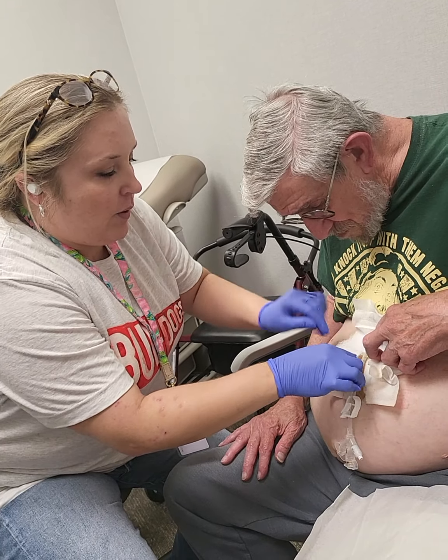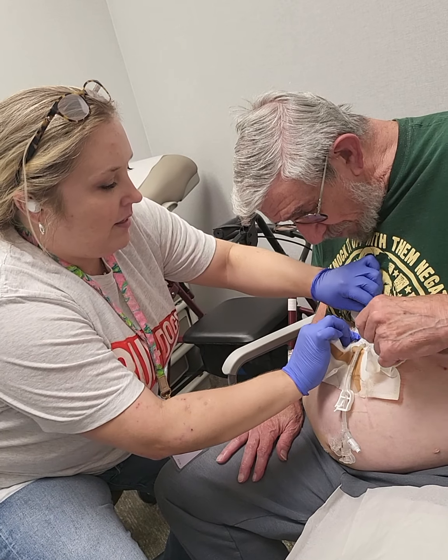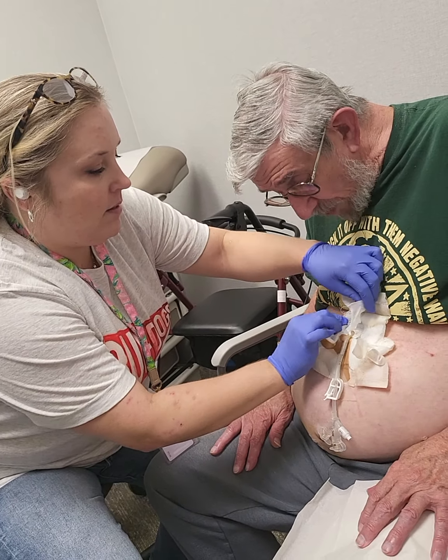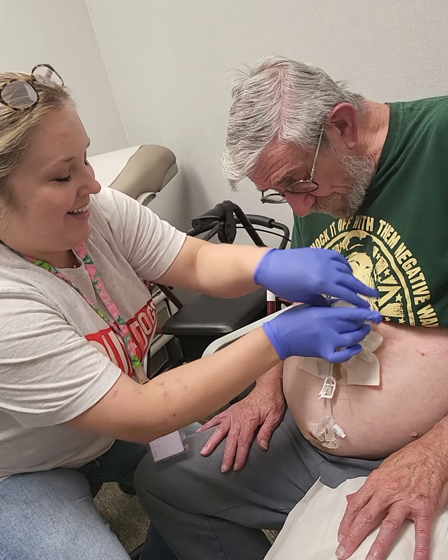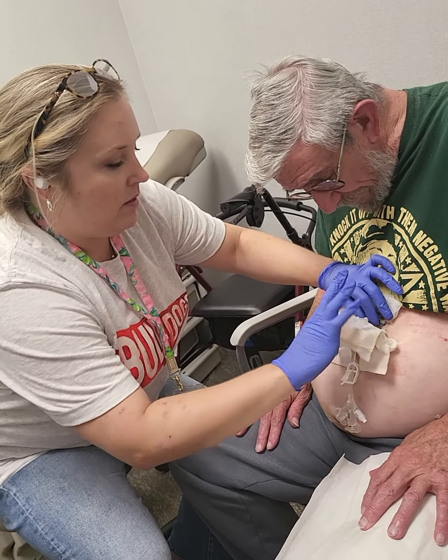Now you have a clamp, so when you open it it's not going to go everywhere. We're going to show you how to put a piece of gauze under there. It looks like it's sandwiched on there underneath.